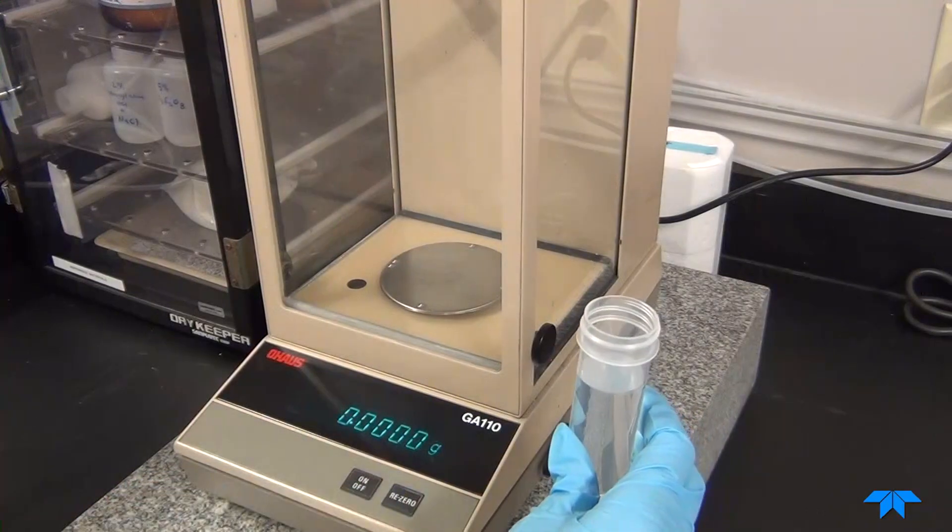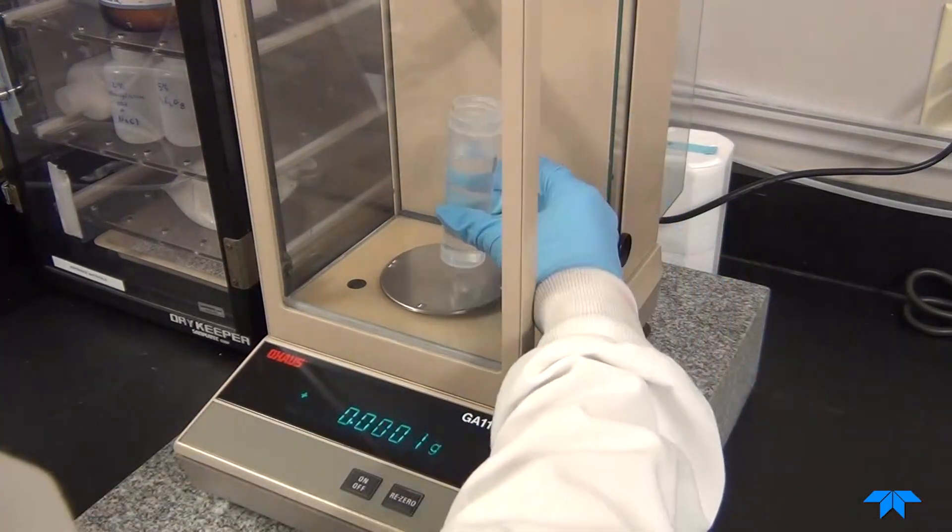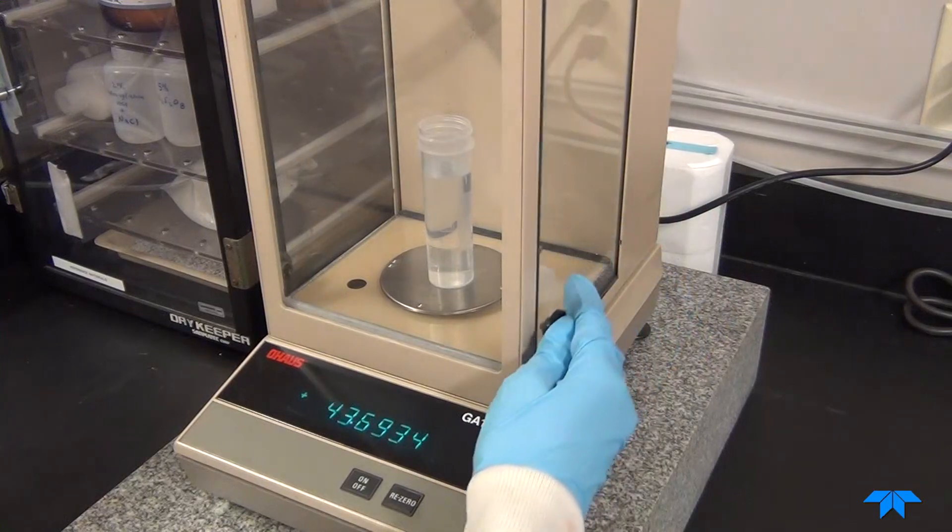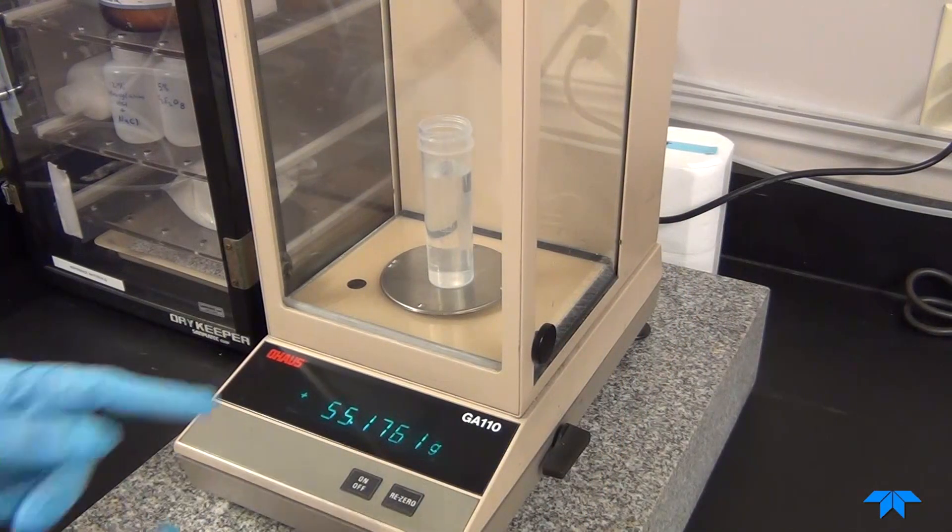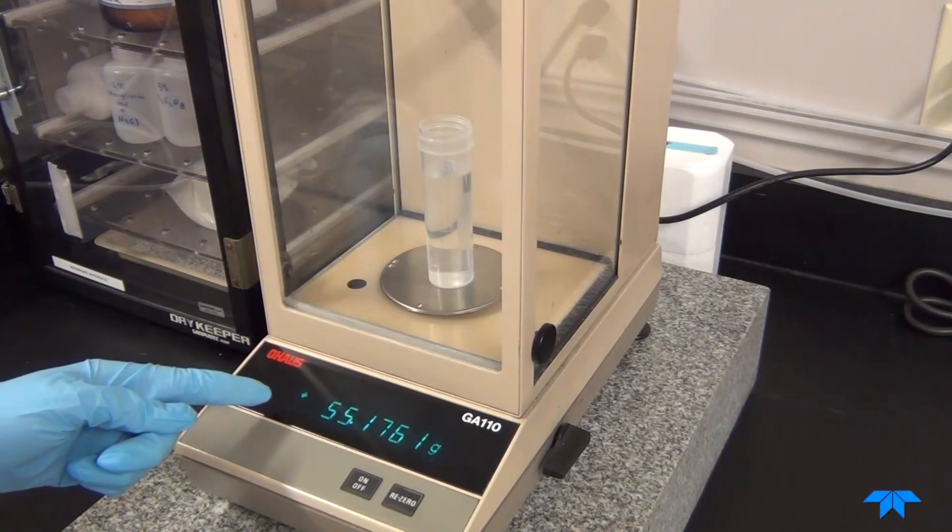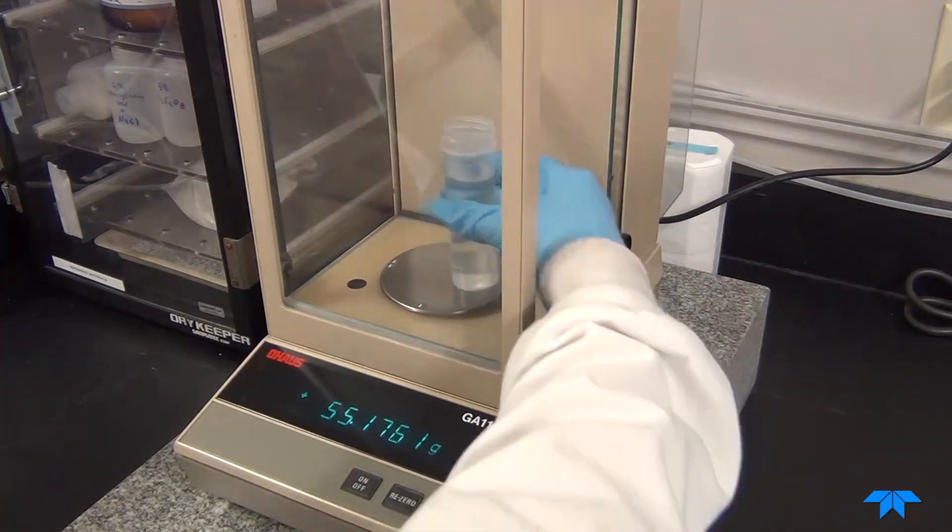Next, tare the balance, then place the container on the balance, allow it to stabilize, and record the starting weight of the container. This is the before weight. Our before weight is 55.18 grams.